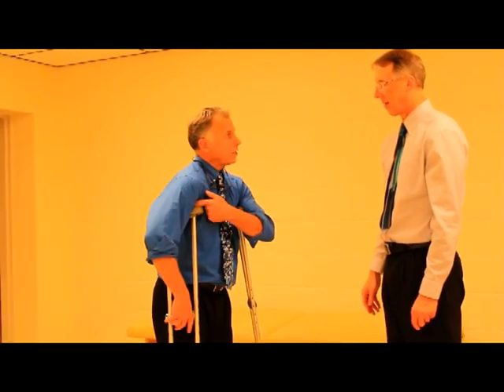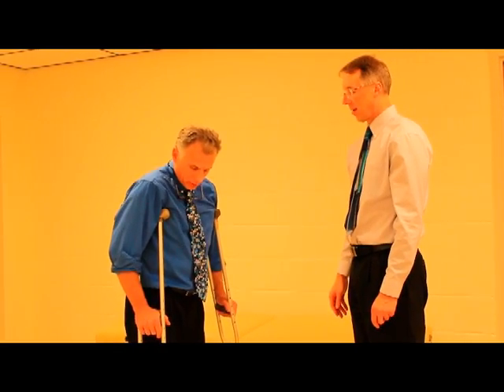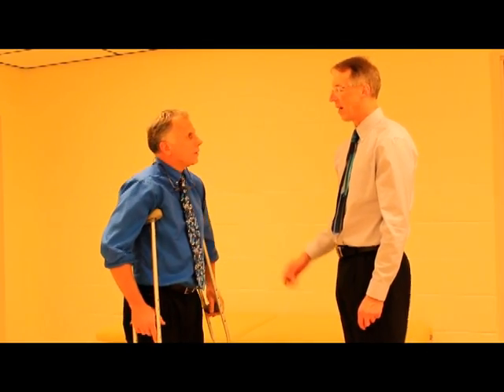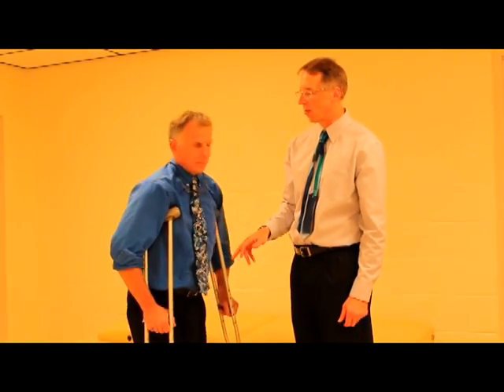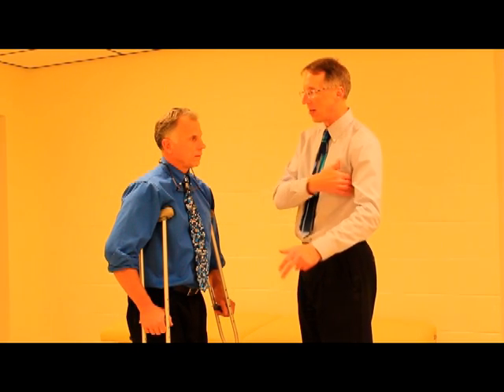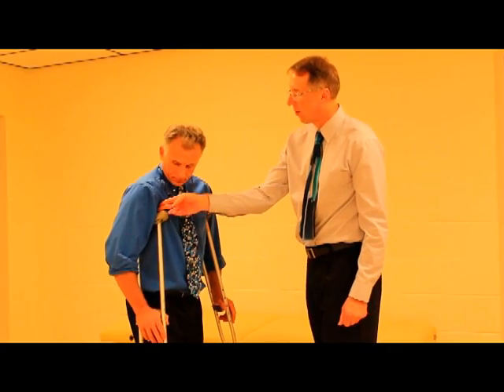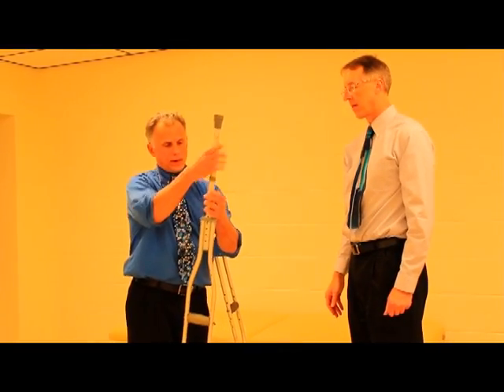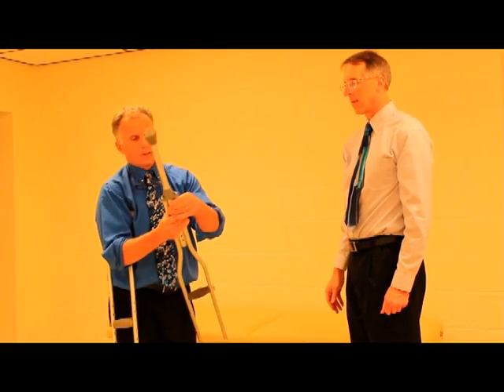Actually right now these aren't touching my armpits — they're a little bit tall. A little bit tall. I could drop down an inch and I think I'd be a little bit better, because you do not want these pushing into your armpits when you use the crutch. That's where a lot of people make the mistake — they think that they're leaning on the crutch. That's the last thing you want to do: you have nerves, arteries, and veins traveling underneath your armpit, and you'll put pressure on them and get numbness or tingling. So you want to have two fingers' width underneath there when you're standing up straight. I'm going to drop these down and see what it feels like. Oh yeah, that's definitely more like it.